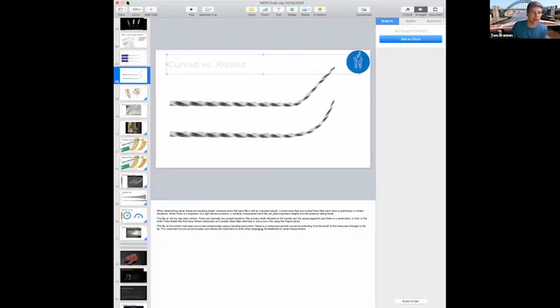So you can see that it's got a curvature that's going distally. Then you want to almost pre-curve. Do you know when I say pre-curve file? I've got a picture of a pre-curve file as opposed to a pre-bent file. So this is the difference between a curve and a kink.